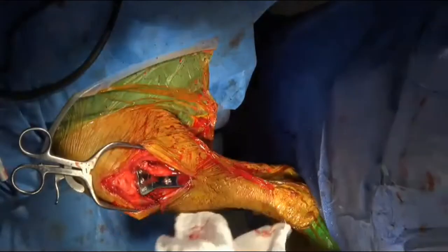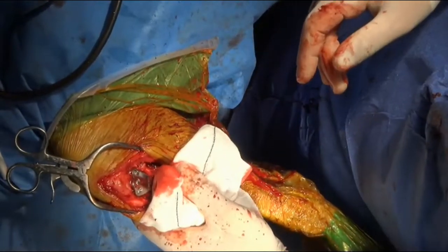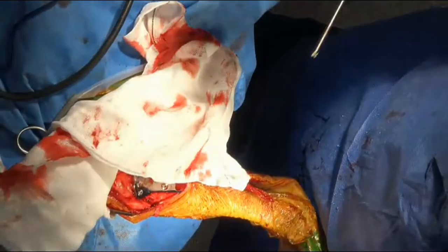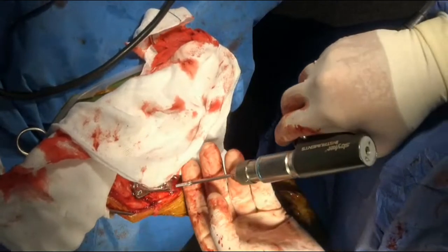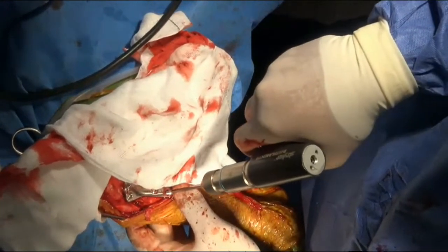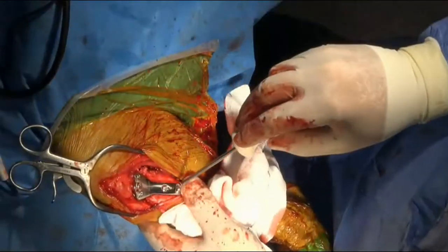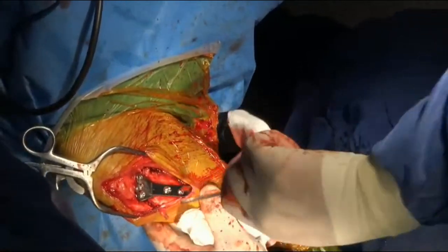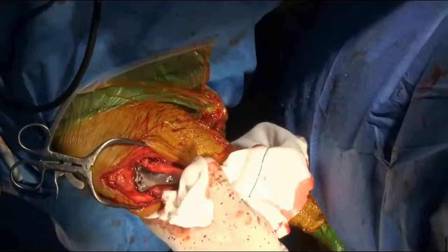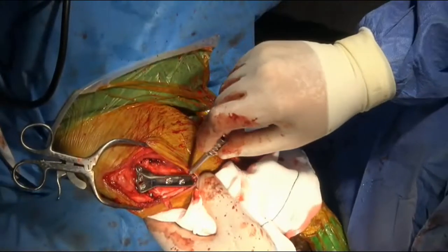Just a 22, please. So I'm just power driving these at the start, and then I finish this off with a hand driver. You can get torque limiters, but we don't have one, and I don't mind actually just tightening them up by hand.